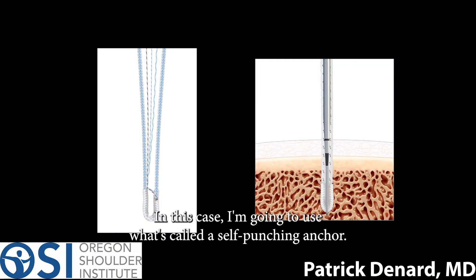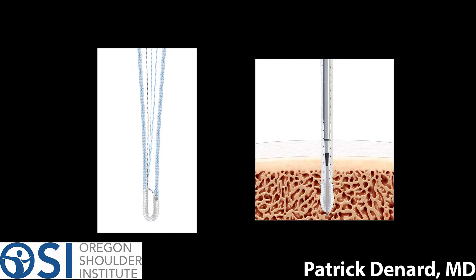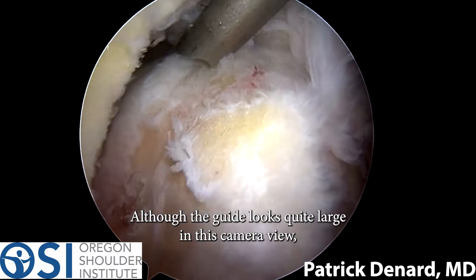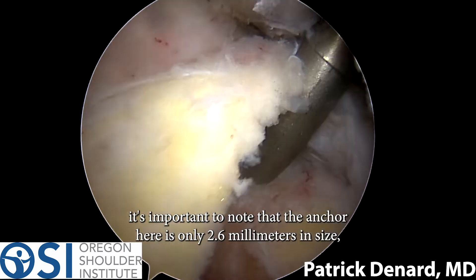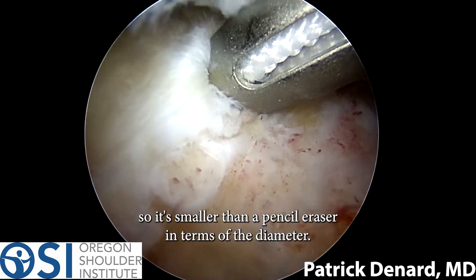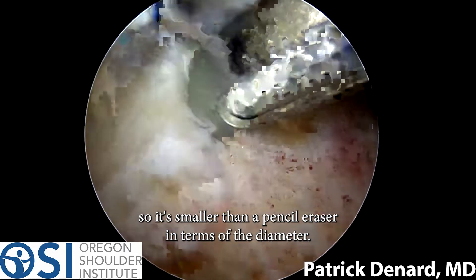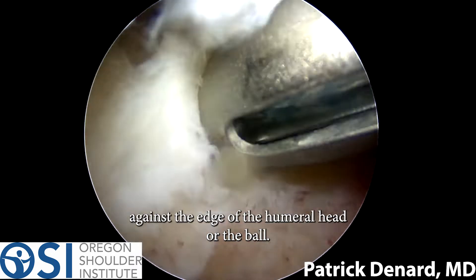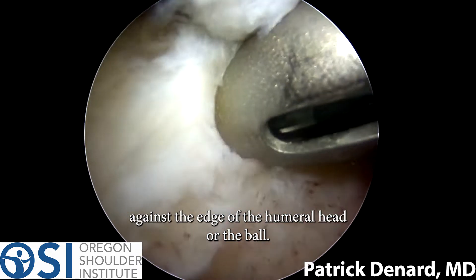In this case I'm going to use what's called a self-punching anchor. This is going to be placed through a guide. Although the guide looks quite large in this camera view, it's important to note that the anchor here is only 2.6 millimeters in size, so it's smaller than a pencil eraser in terms of diameter. This is placed directly into the bone against the edge of the humeral head, or the ball.